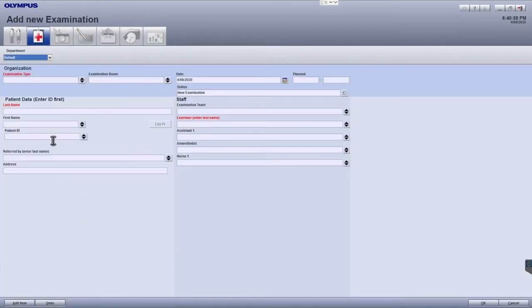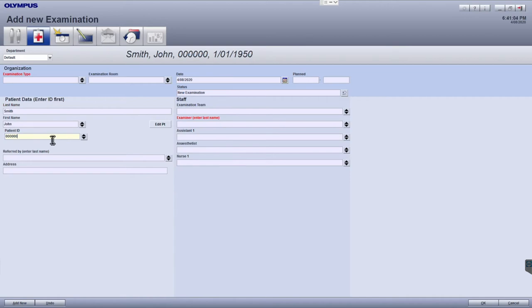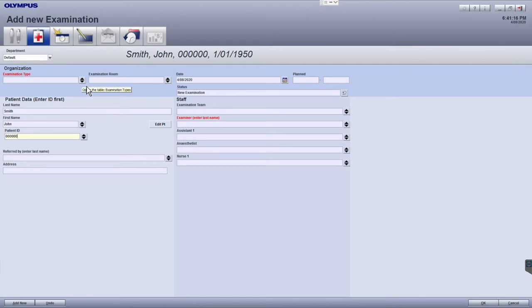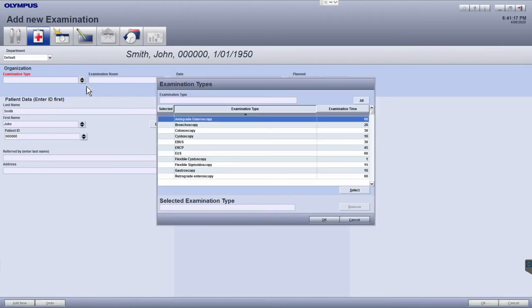First enter the patient ID to see if this patient exists in the database. If the patient exists, the other patient details will populate automatically. Enter all relevant examination details for this examination by clicking on the arrow next to each field to display the available options.